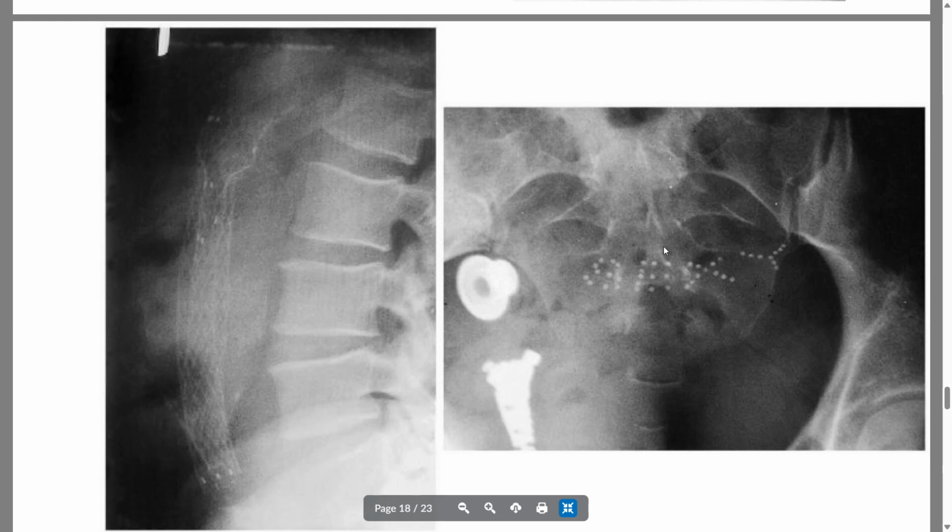On the right, reasons why patients should be properly gowned and shielded. So this patient is wearing jeans or something with a button and a zipper. We always make sure that they're not wearing something like that, especially when we're taking a sacral x-ray. Turns out this patient's also wearing bedazzled underwear.